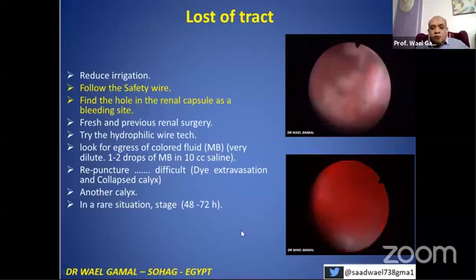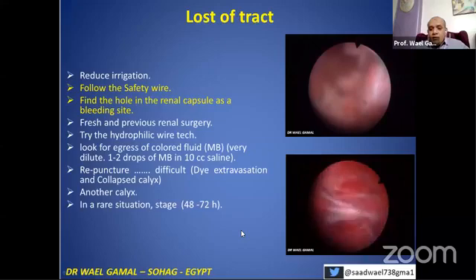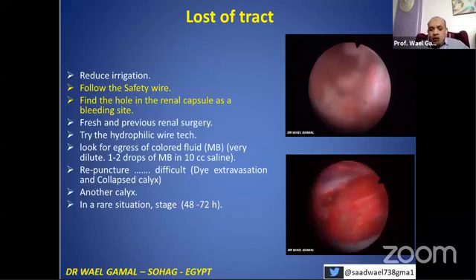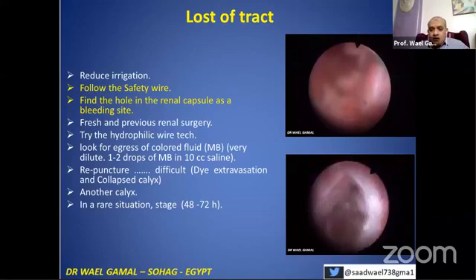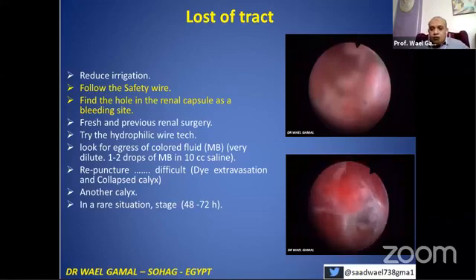If you have a safety wire, follow it. Or if you don't have a safety wire, reduce the wash and the irrigation, looking here and there for the opening. Try to be very meticulous. You will find it in between the perinephric tissue.